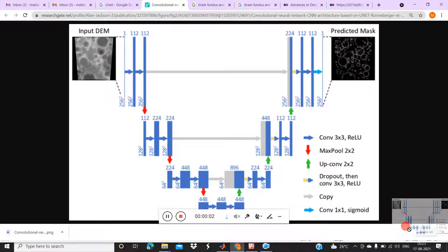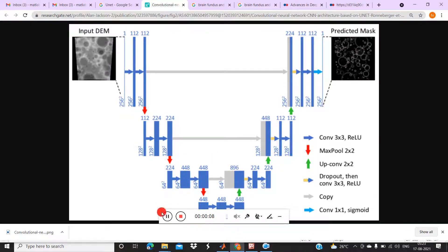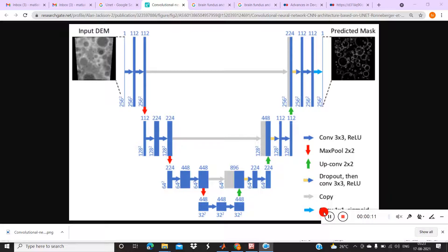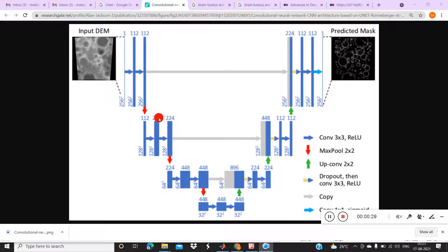Hi guys, today I am going to teach you how to do image segmentation using deep learning techniques in MATLAB. I will show you three different image models: brain tumor, fundus exudates, and liver segmentation. For all these image model segmentations we are using the U-Net, which is a segmentation model we can use for any image processing as well as medical image processing.